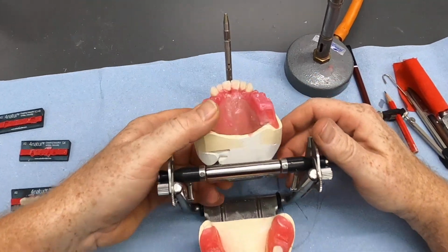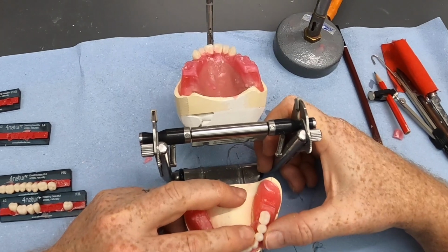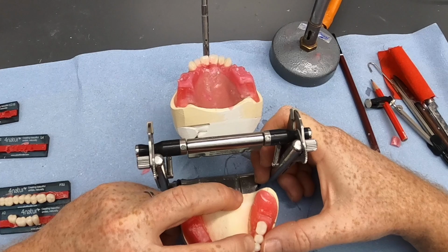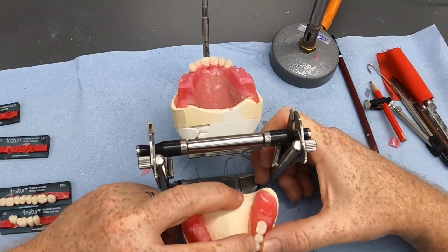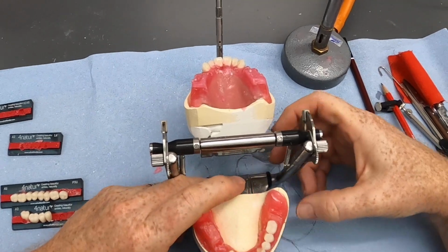Anyway, let's have a look at what we can do with our denture. So we've got our teeth lined up here with the central fossa over the alveolar ridge. When we're working with lingualized occlusion, we actually reverse the relationship on the 4, and we have the buccal cusp of the 4 contacting the central fossa of the upper.